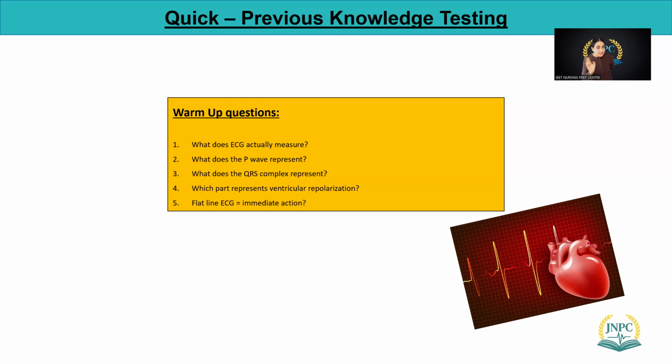When you see pulselessness, no pulse, the client is unresponsive, not responding at all, then we give CPR. But when do we give shock? When there is some sort of issue with the rhythm. The rhythm is there, electrical conduction is there, and we have to reset that abnormal rhythm to the normal one. So we reset that abnormal rhythm with shock, and shock is again, we use the term cardioversion, we use the term defibrillation. We will do that now.